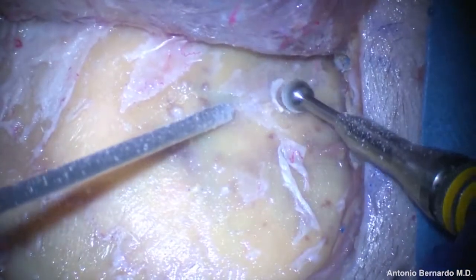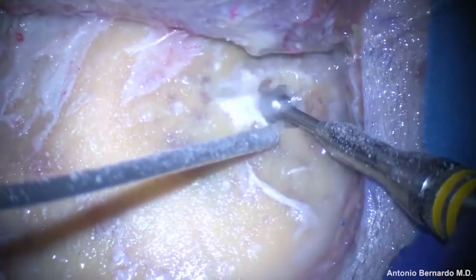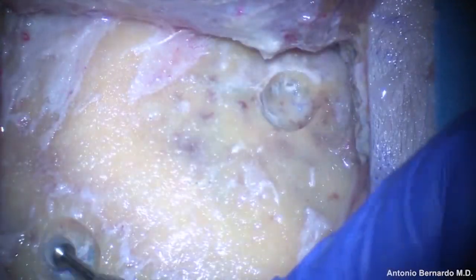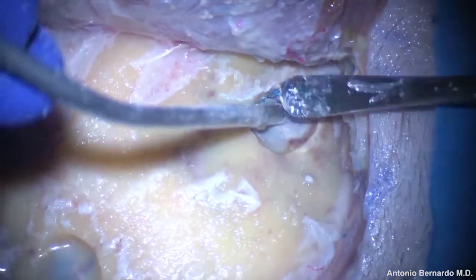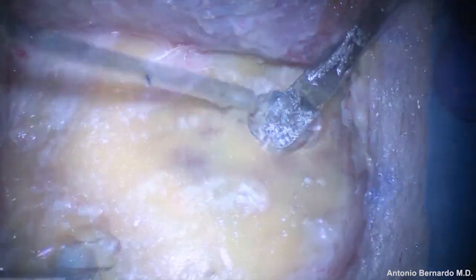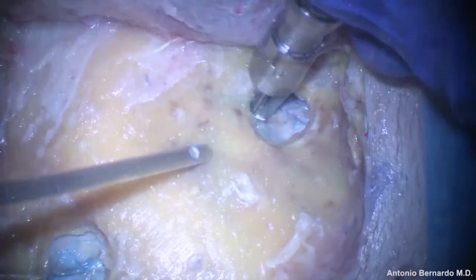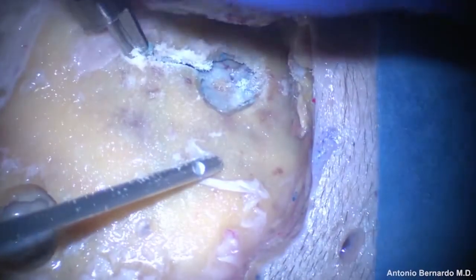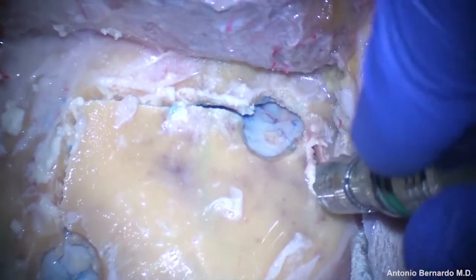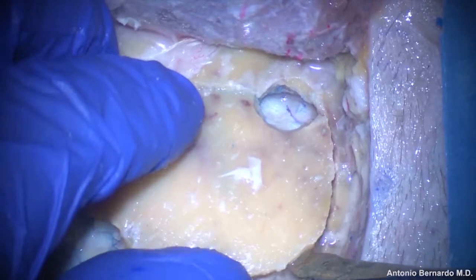In a cadaver setting, it is always advisable to do more than one burr hole, because the dura is particularly attached to the inner side of the bone. A standard craniotomy is performed. Care is taken not to injure the underlying dura. The bone flap is elevated.